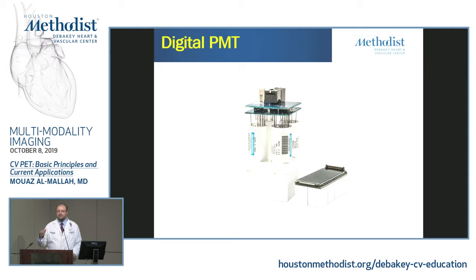So that's why these new systems, which have been available now just for the past 2 years, allow you to even give lower doses to the patient, because you're going to be able to amplify it more and get a better image quality despite using lower dose.